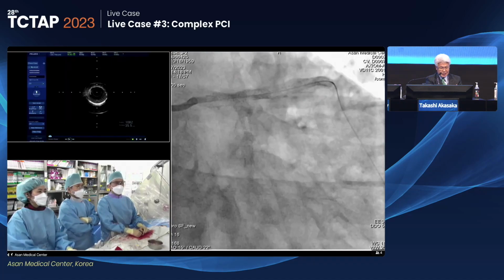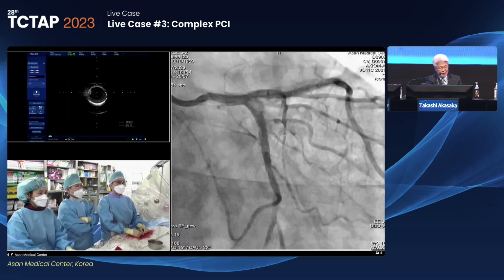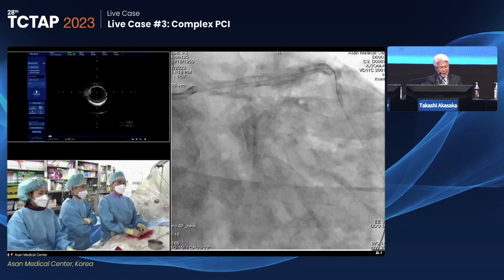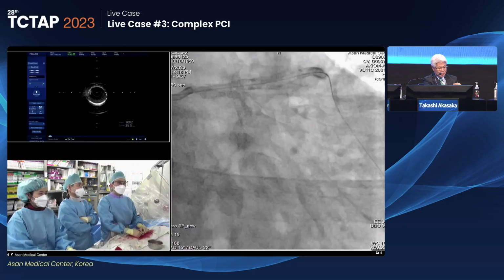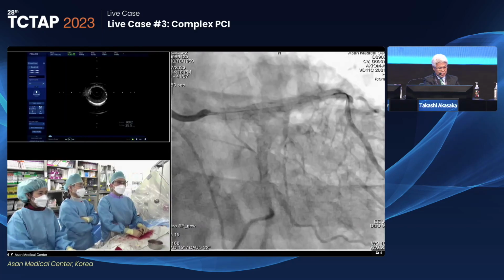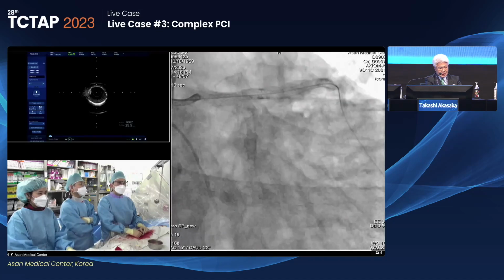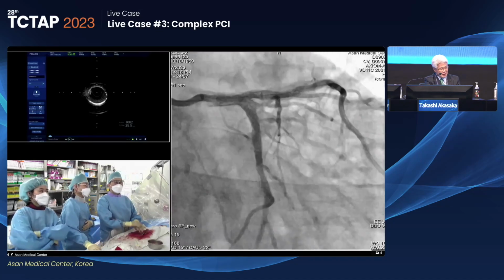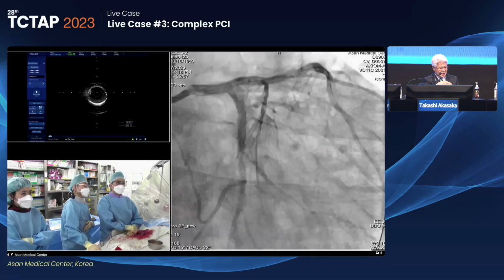But generally speaking, if there is tissue growth, sometimes coming from the metal carina, and you can only pass the wire from the proximal site through the CX orifice, right? At that time, if you dilate, the stent strut goes up to the main branch, right?